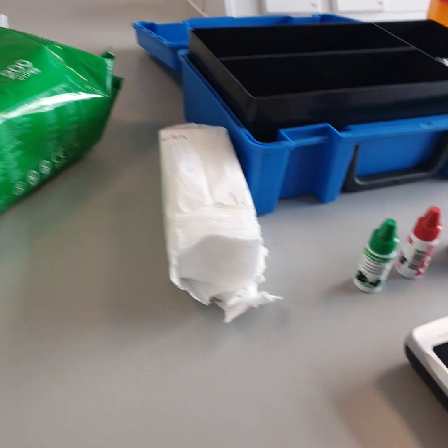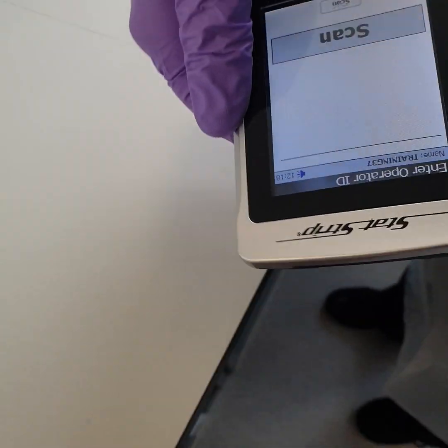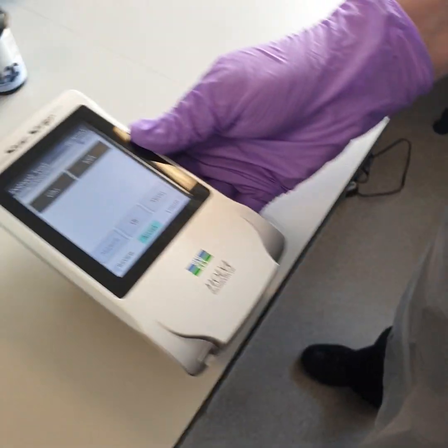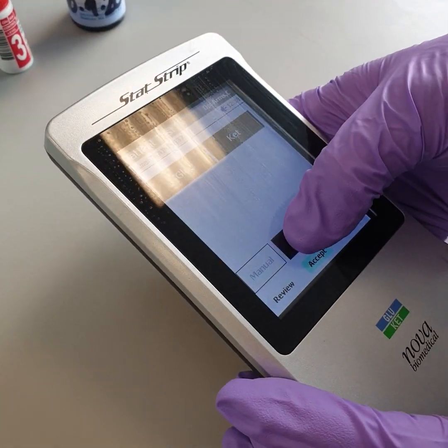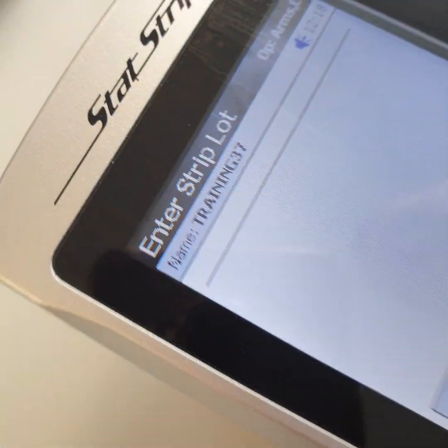Click login and scan your barcode. Click QC. From this point, please follow the prompts on the top bar of the screen.